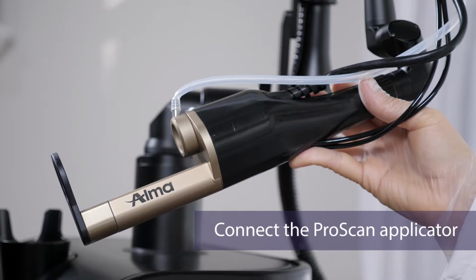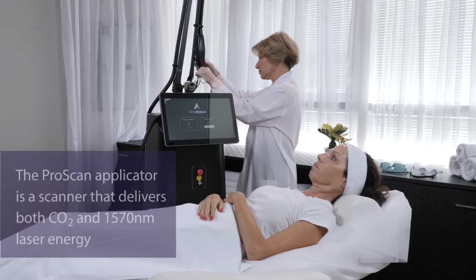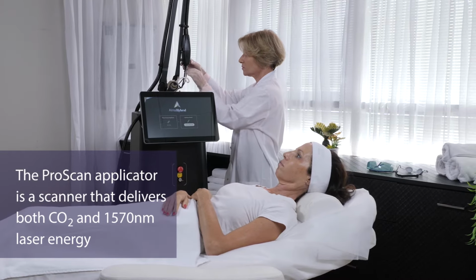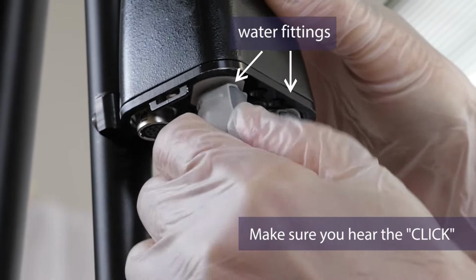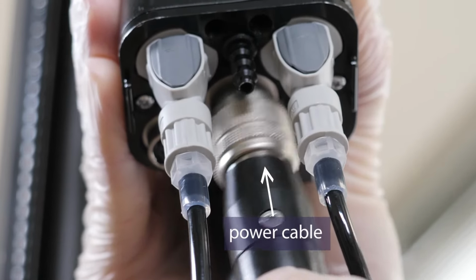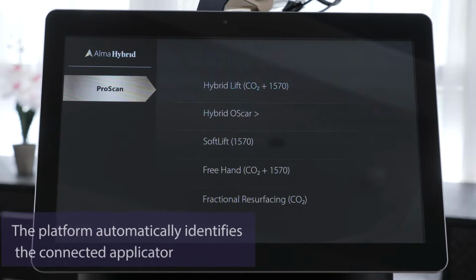Connect the ProScan applicator. The ProScan applicator rapidly delivers both CO2 and 1570 nanometer laser energy within a large scanning area. First, connect the two water fittings until they click into the locked position. Next, connect the ProScan's power cable to its connector. Once the applicator is connected, the platform will automatically display a menu showing the available treatments.